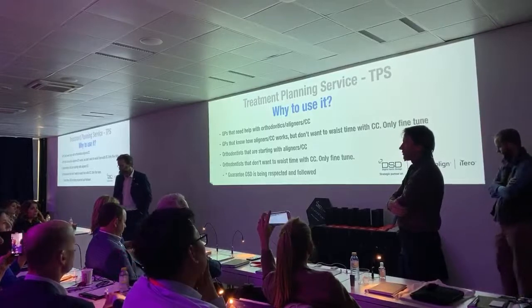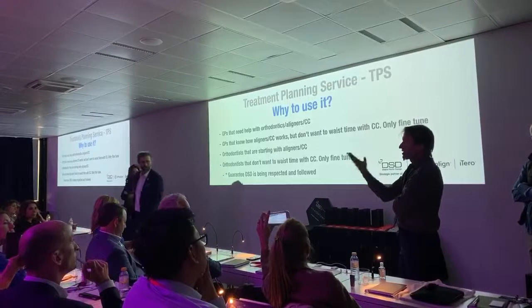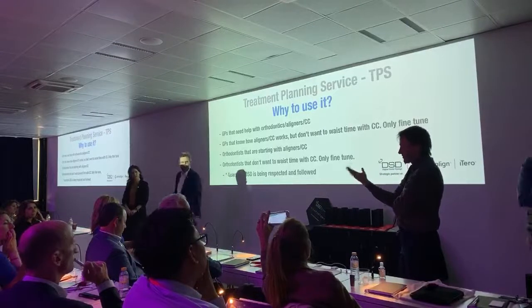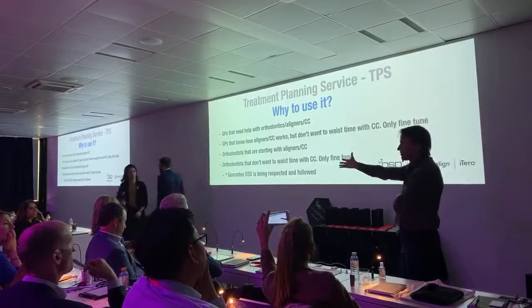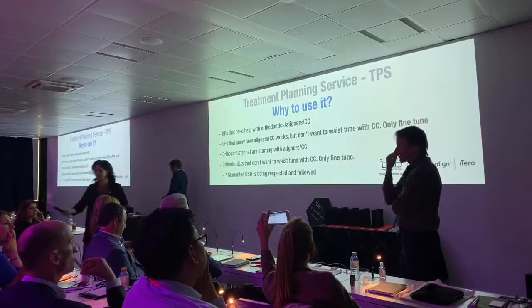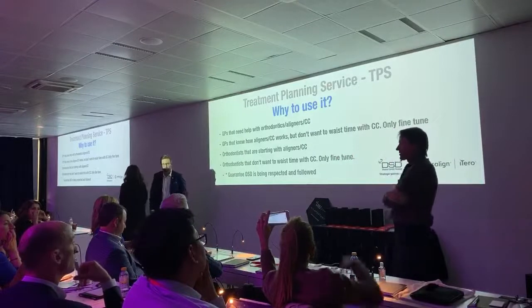The other thing you can do is receive the whole plan from the planning center and share the presentation with him. Say, tell me what you think, what are the modifications, how do we finalize this treatment plan, because I need to present tomorrow to my patient. You share the DSD presentation with the orthodontist.